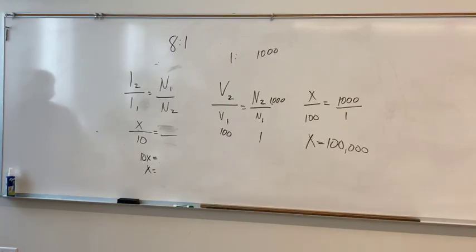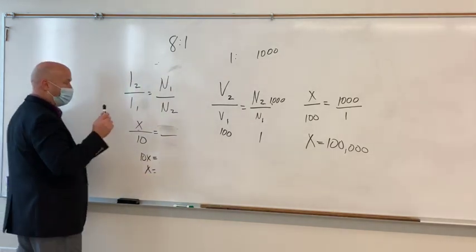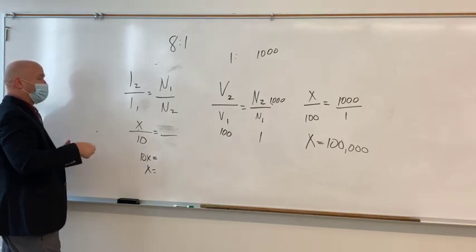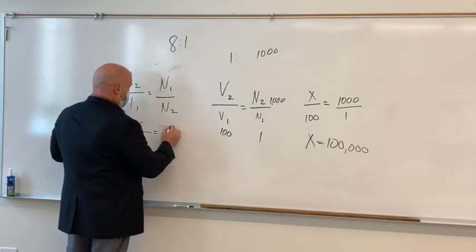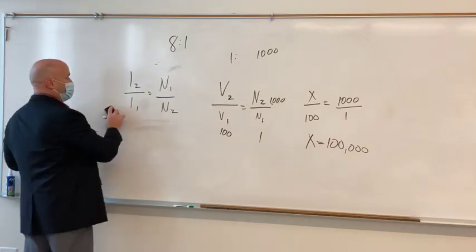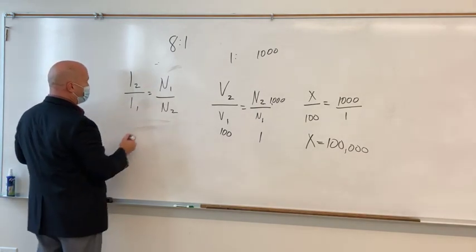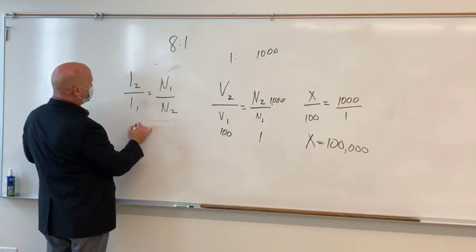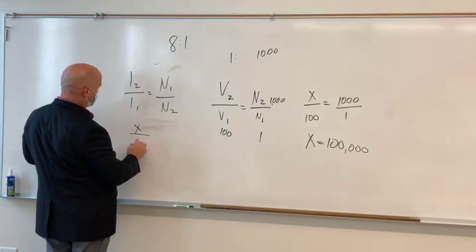Intensity. Okay. No, I'm not going to stand up here until I figure out exactly what I'm doing wrong, but a step-down transformer is going to step down voltage. I'm working amperage. That was right. So instead of doing that, let's go back to our illustration there. Okay, so our voltage increased, our amperage should decrease. So I've got intensity is equal to X. I'm still kind of running into the same thing.